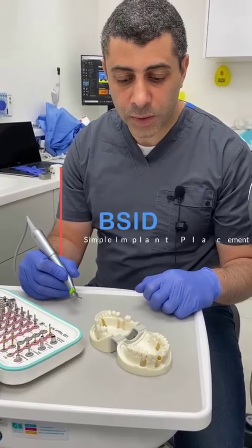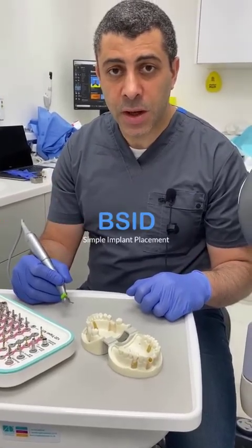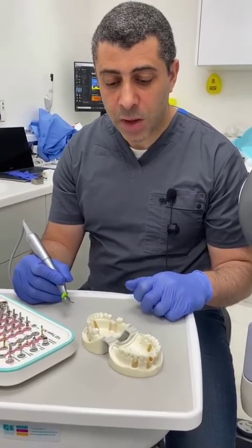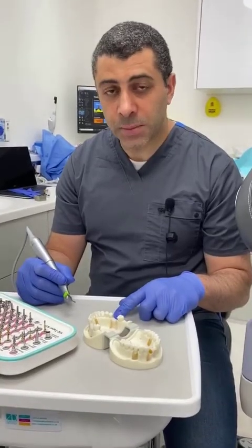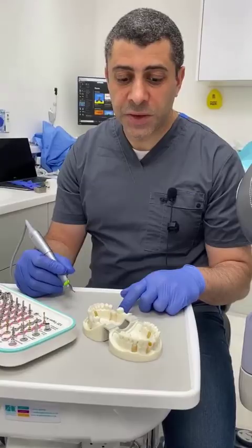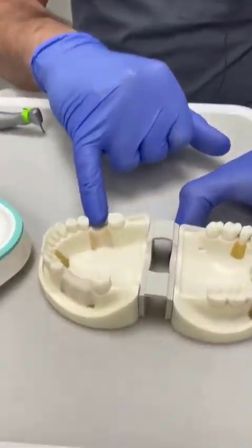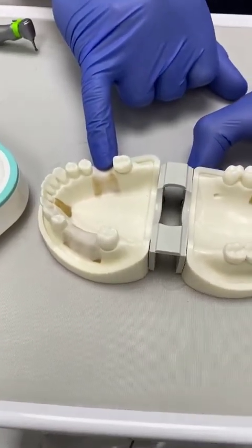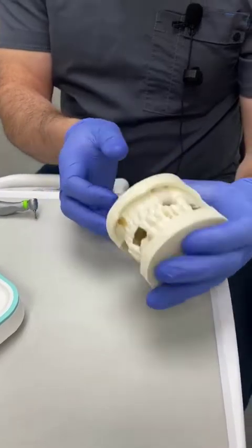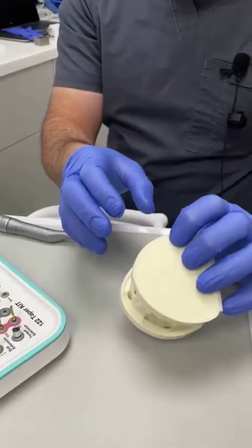Hey everybody, this is Ali from the British Society of Implant Dentistry. I would like to demonstrate the placement of a dental implant on a plastic model using the OSTEM system. Before we begin, just to give you an idea of what we're going to do: we're going to be placing a dental implant in the lower right six position. This model is good because you can see the opposing dentition, and I'll show you why that's useful very shortly.